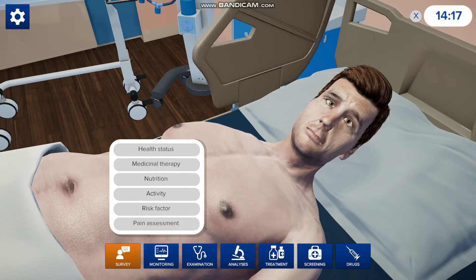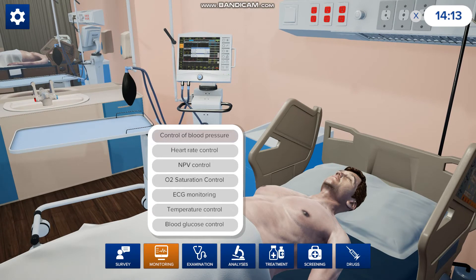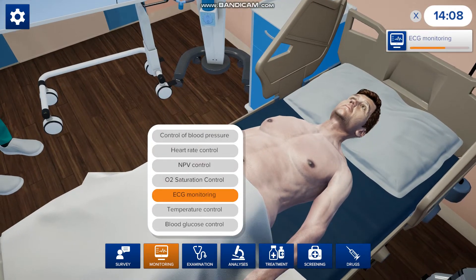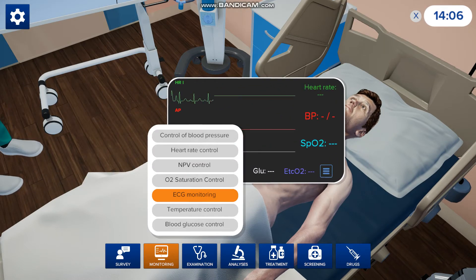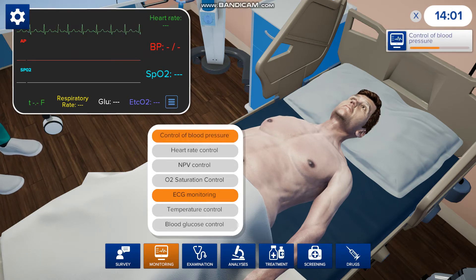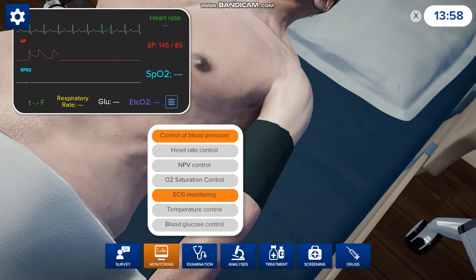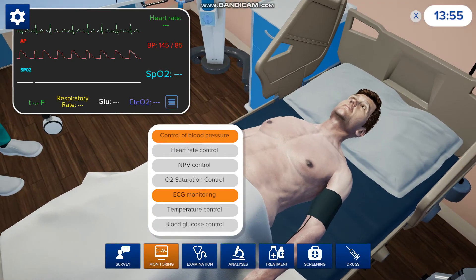Once you finish that survey you can go to monitoring and you can check for ECG monitoring. It will take a second but then the vitals will pop up. If you want to check blood pressure, you press that and then a blood pressure cuff will pop up on his arm as well, and then it will pop up onto the monitor.